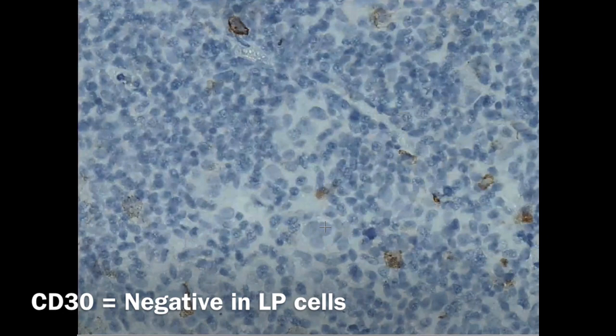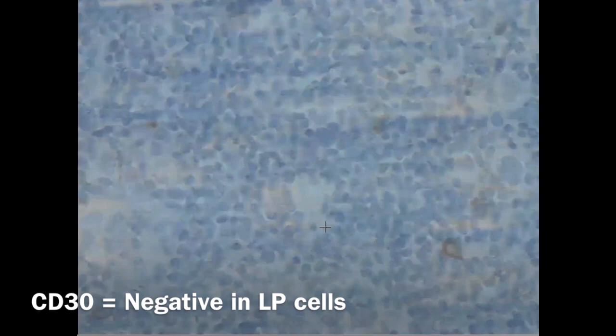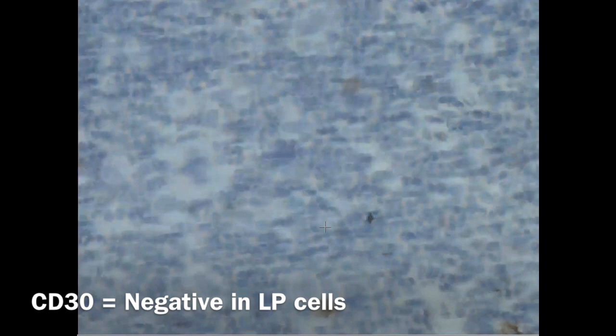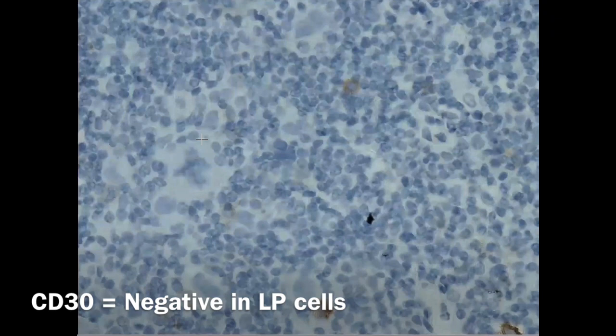Confirming that these cells do not take the CD30 stain. Here is another large cell not taking the stain, and another cell not taking the stain. So they are CD30 negative — this is what I want to confirm.